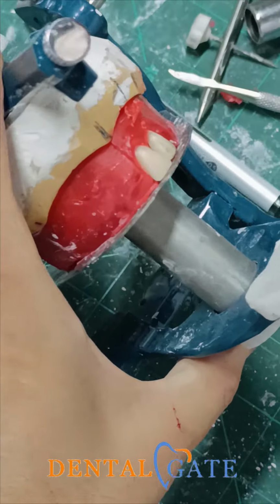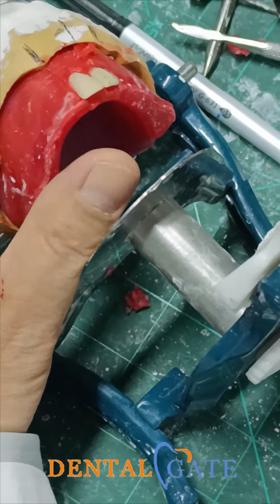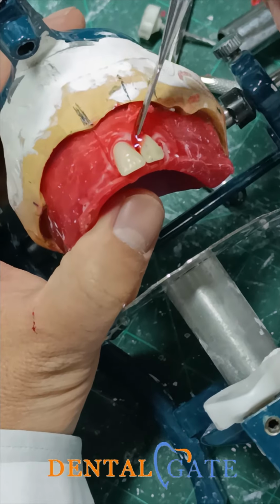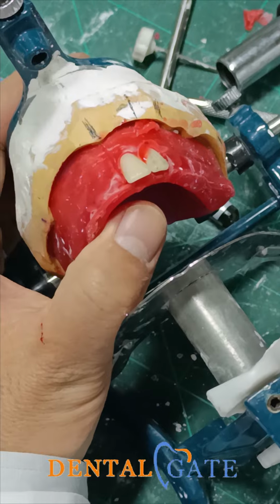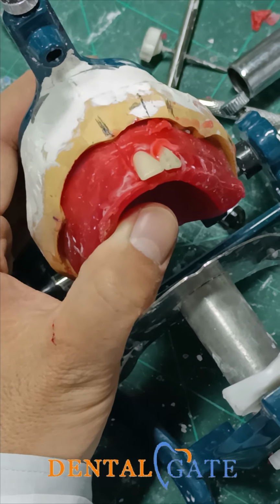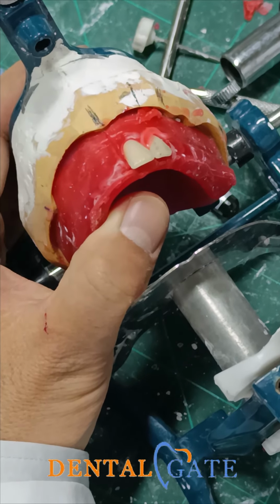You can fold the melting wax here to provide good sealing. So please, when making the arrangement, don't make any carving. Don't cover the tooth with wax. The long axis should be clearly identified.